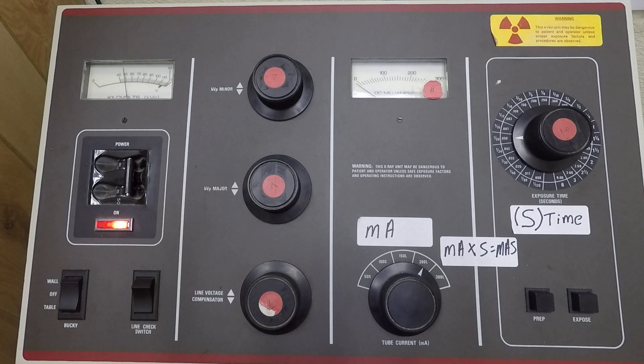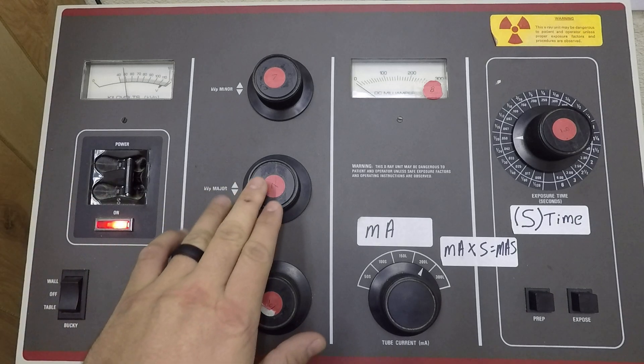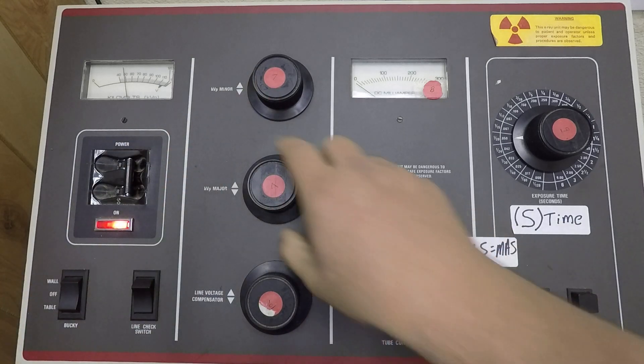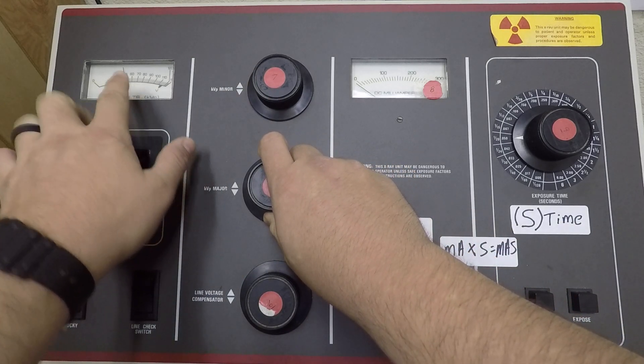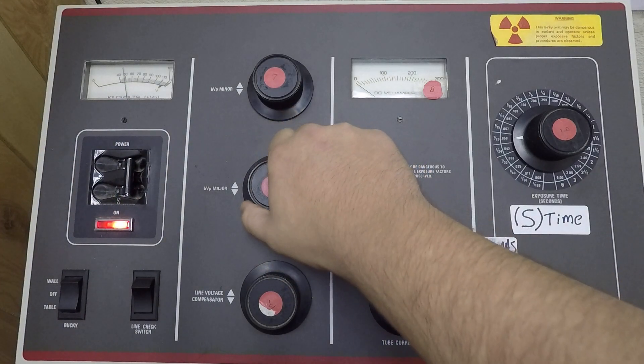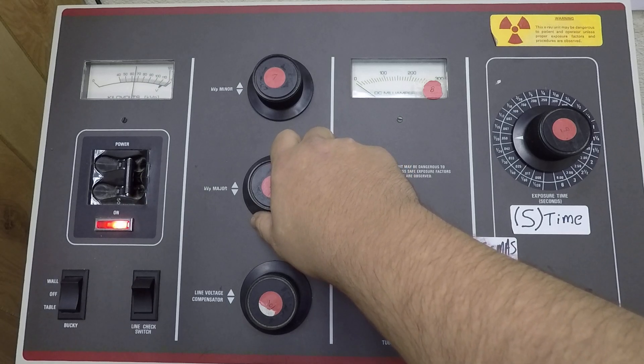When we set KV on, at least on our control console, we have a major adjustment and a minor adjustment. If you look at the KVP meter up here, the major adjustment moves us by a lot. I was just at 50, I made one click, and now I'm at roughly 66.